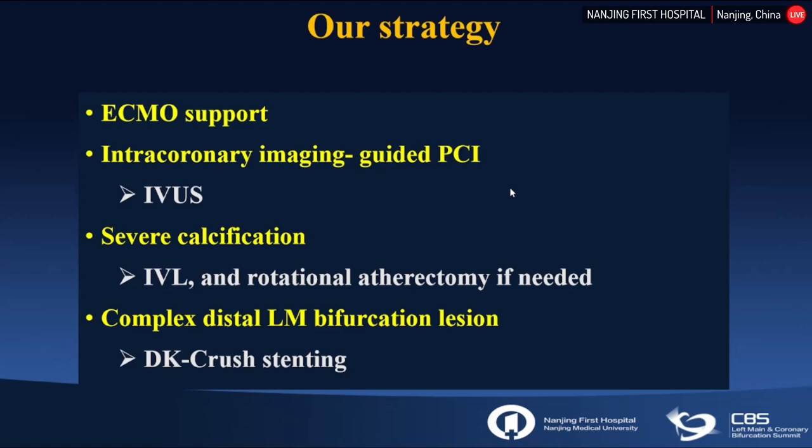Next. After a hard discussion, this patient and her family refused CABG. So today we plan to perform PCI for this patient. We plan to perform IVUS-guided PCI with ECMO support for this CHIP case. For severe calcification in the LAD, left circumflex, and left main, we plan to use intravascular lithotripsy, with rotational atherectomy on standby if needed. For the complex distal left main bifurcation, we plan to use the DK crush stenting technique according to the DEFINITION II trial. That's all.